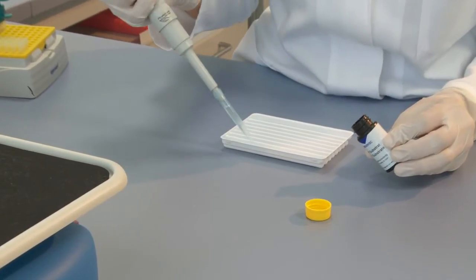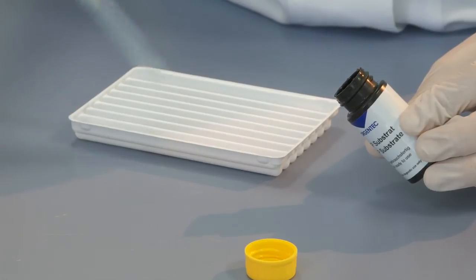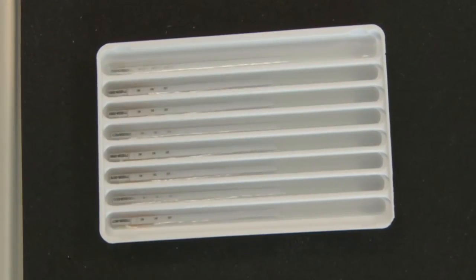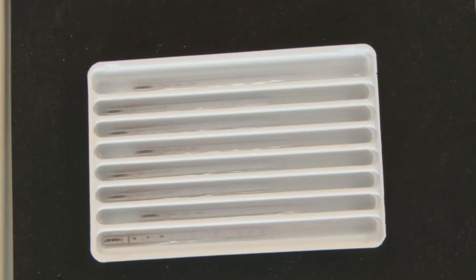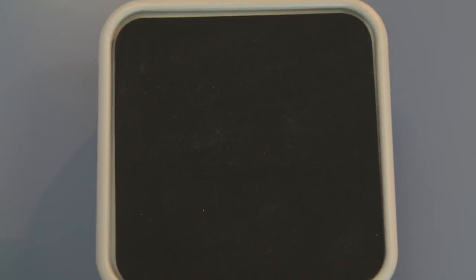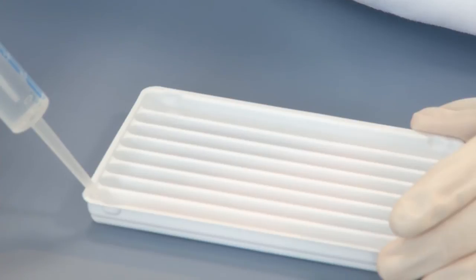After the final washing procedure and complete removal of the wash buffer, one milliliter of the substrate solution is added to each strip. During the subsequent 10-minute incubation period, the enzyme coupled to the secondary antibodies transforms the colourless or faintly yellow substrate into an intensely purple end product. A purple line on the strip indicates the presence of an autoantibody in the serum sample that reacts with the antigen fixed to the test strip at that location. The strips are then washed three times for five minutes with one milliliter of distilled water to remove excess substrate and to stop the reaction.